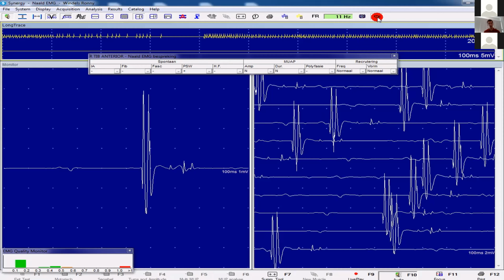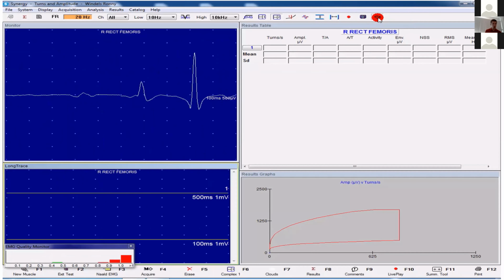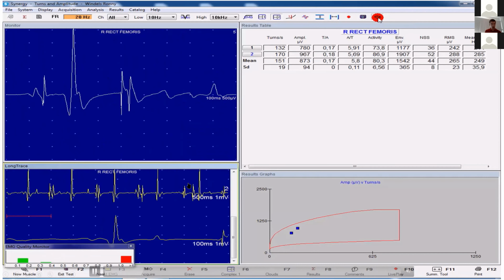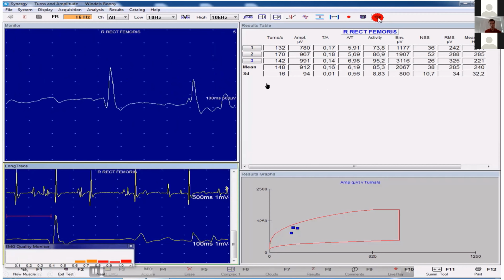This is still semi-qualitative analysis. Now we're going to go to semi-quantitative analysis. What we measure here, on top, is the normal contraction pattern. I'm looking for a sharp motor unit, which means that on the EMG quality monitor, I want to see green with a sharp rising time. If I have a sharp motor unit, I try to record this motor unit over here. This recording of the motor unit gets analyzed by the computer software over here.